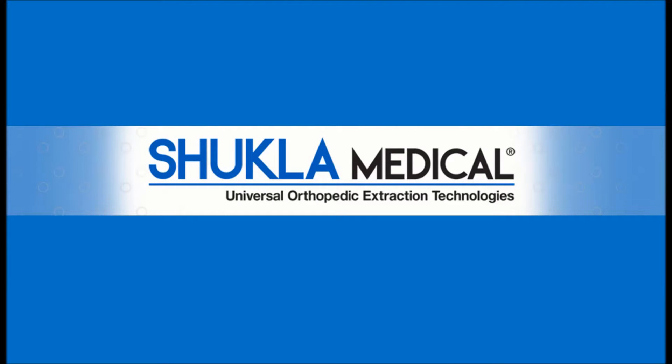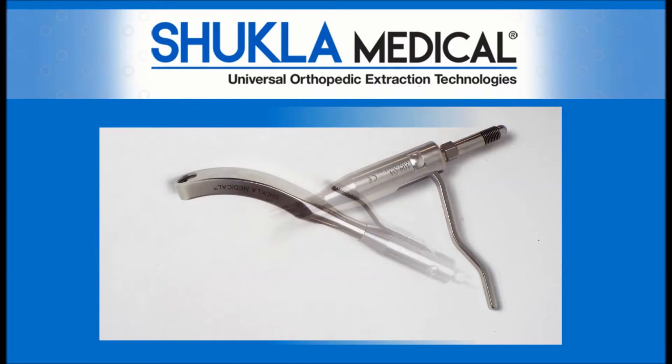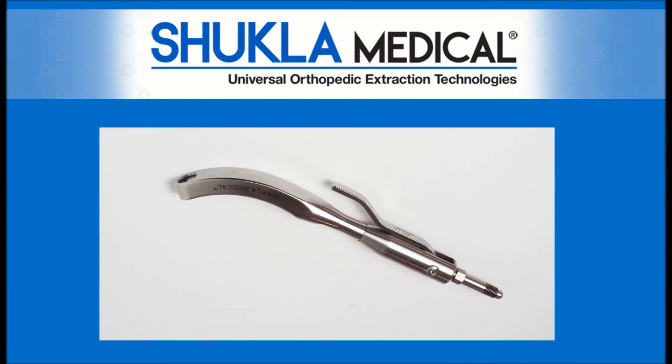Shukla Medical, the hardware removal experts, has made a significant upgrade to our universal hip stem extractor. This upgrade ensures proper assembly, increased pushrod life, and a positive closing cam handle.